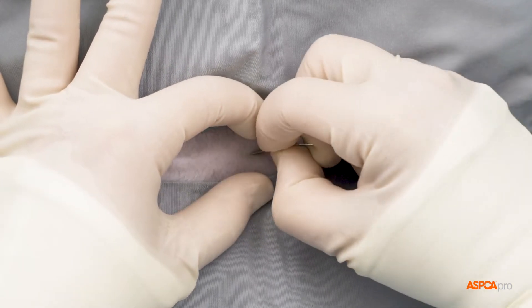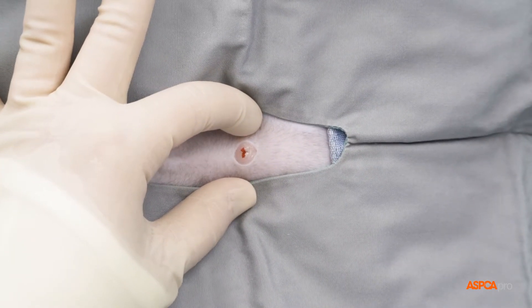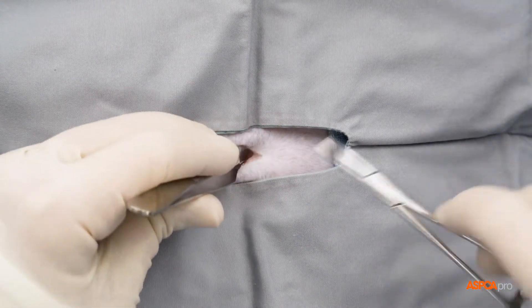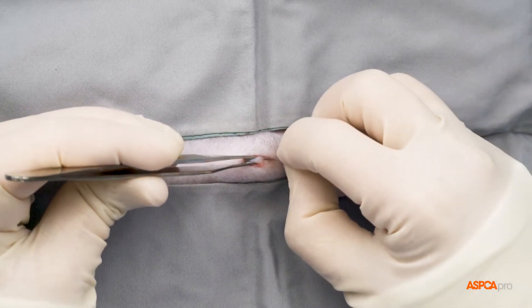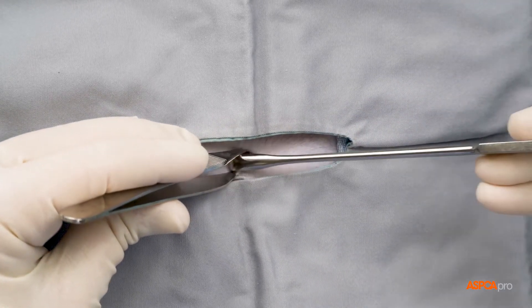First, an incision is made through the skin layer of the ventral abdomen. A hemostat or scissors are then used to clear fat and tissue from this area, so the surgeon has an unobstructed view of the next layer. They then cut through a central band of fibrous tissue and into the abdomen, creating an opening that allows them access to the abdominal organs.